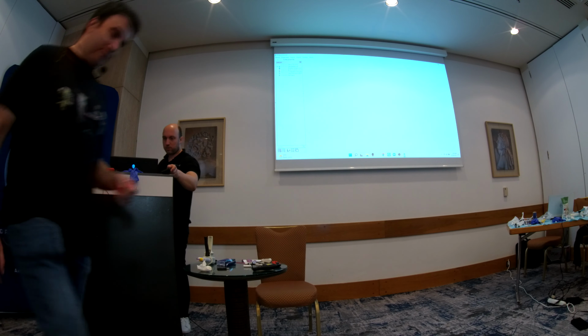So we have axiography, individual models, CBCT tomography, and position diagnostics. And we'll start new diagnostics from scratch, from zero.